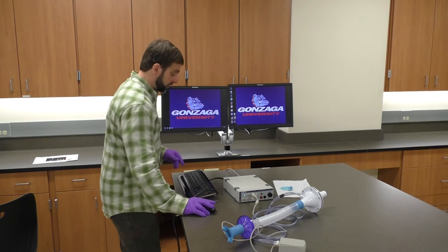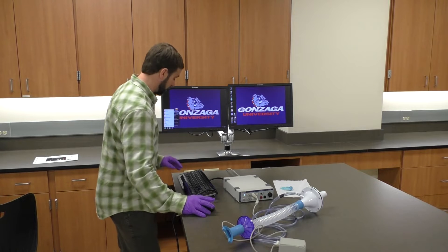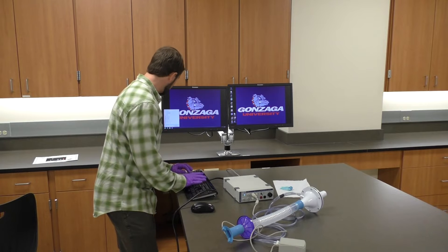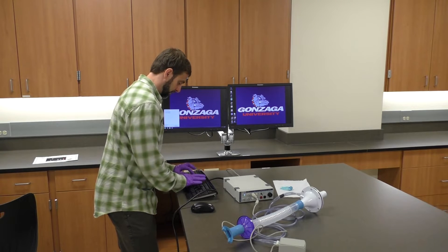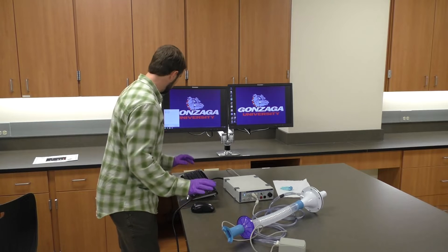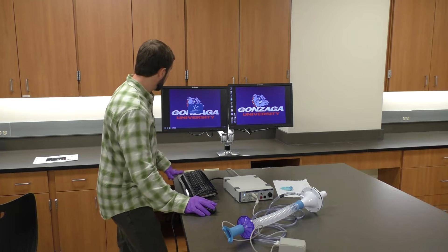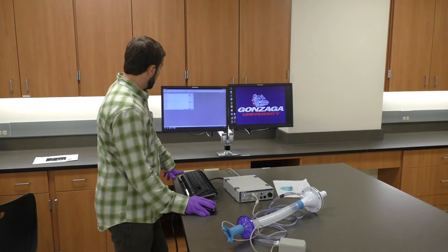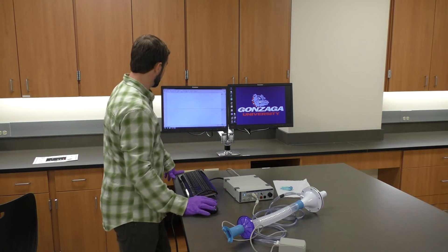At this point everything is set up and the PowerLab is on. I'm going to start up the software by typing in 'respiratory settings' and clicking that. The LabChart software will open up, and I can see a nice green start button, which means the box is in communication with the computer.